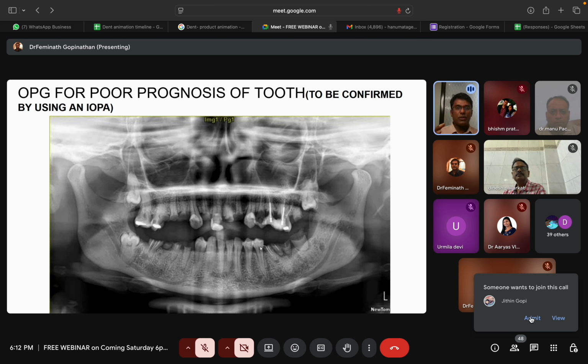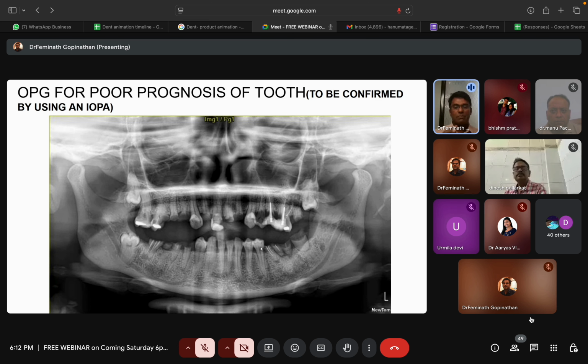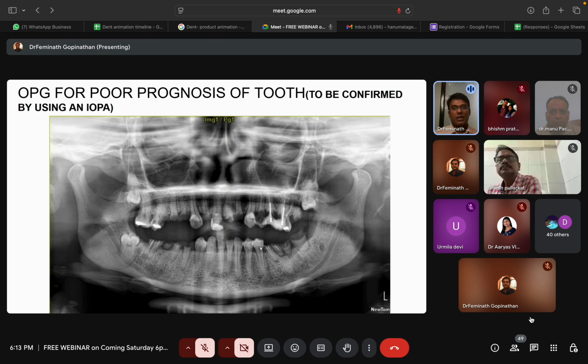If you go for a full mouth, the advantage is cross arch stabilization, one thing, which gives more stability for the implants because the load is distributed equally well among the implants. That is one. The third thing is, since the patient has lost most of the teeth, there is a possibility that in the long run, he might lose the remaining teeth also. So you can ask the patient to decide on these circumstances. And as far as economy is concerned, you just need to place 2 more implants to convert this into a full mouth case.